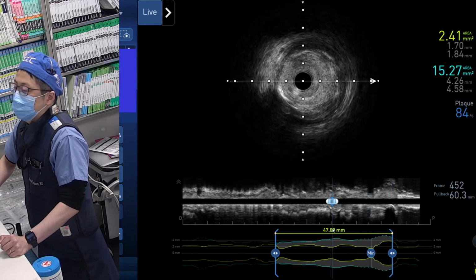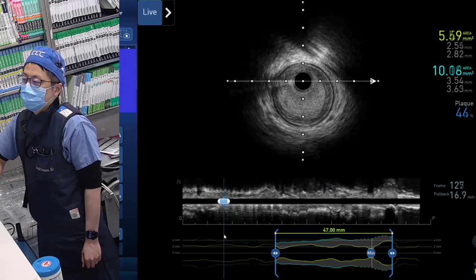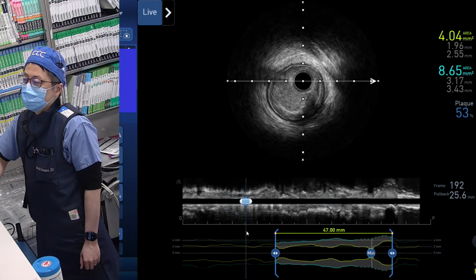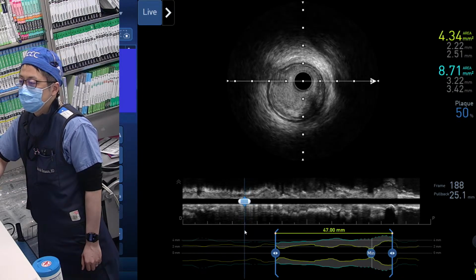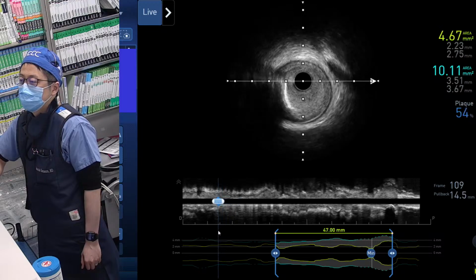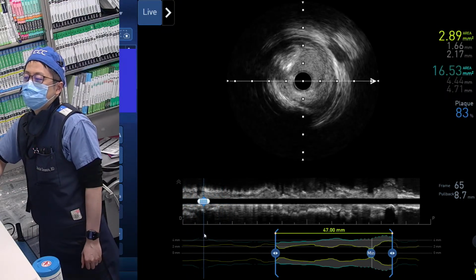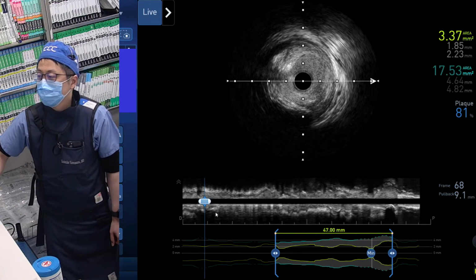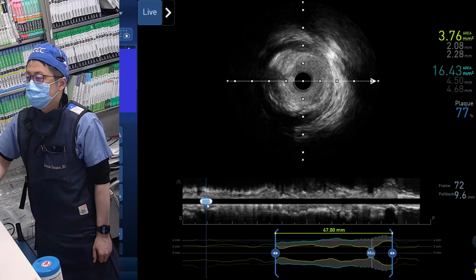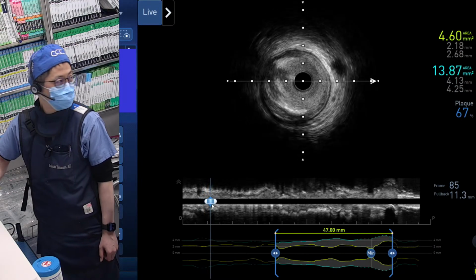Now don't go to the distal. If you go all the way to the distal, there is a tight lesion in the distal. It's true, the area is less than 4, like 2.8. This is the distal RCA lesion, 3.3. You have to cover that lesion, no question. Get a 48, we'll see whether we can stretch it. No, 48 is for the prox to mid RCA.